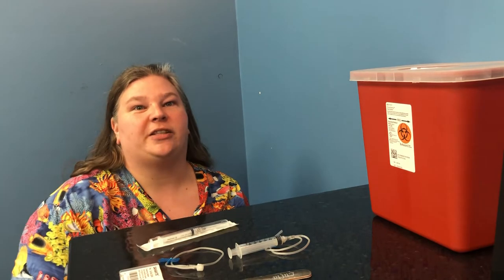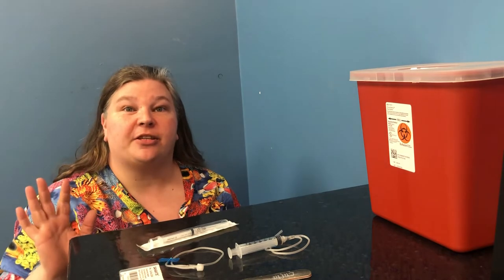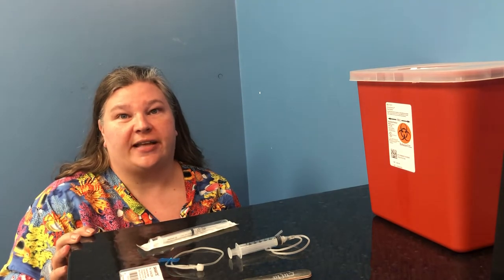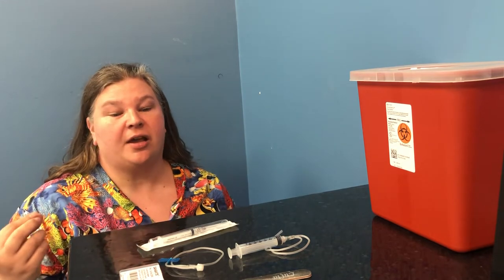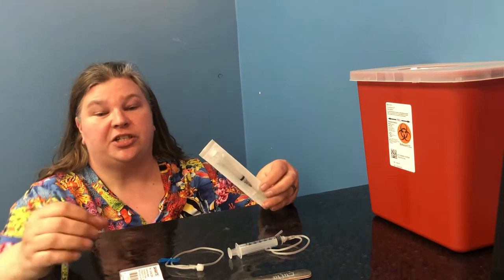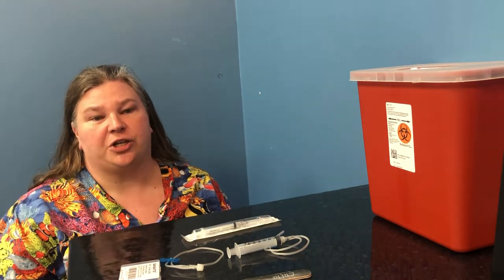Hi guys, it's Monique with Teaching Animals, and I wanted to talk to you just a little bit today about some of the training tools that I send home with clients for cooperative veterinary care training, also that I use with my own pets. Firstly being syringes with training needles and butterflies that have been converted into a training needle.